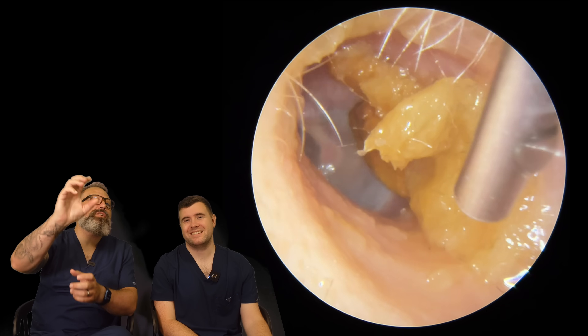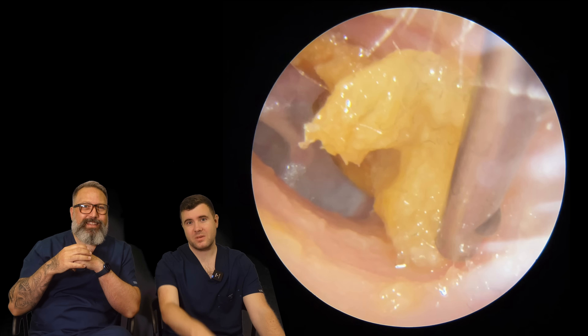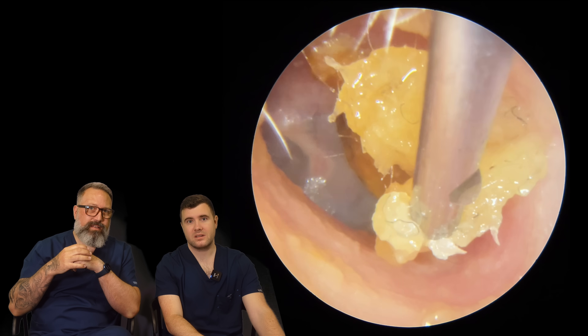Well, it's always nice when you pull it and you can just see the back end is still attached. It's just starting to come down the canal as well. And you can see how clear it is just behind this last bit as well. Perfect. So we've managed to get a nice easy one today.